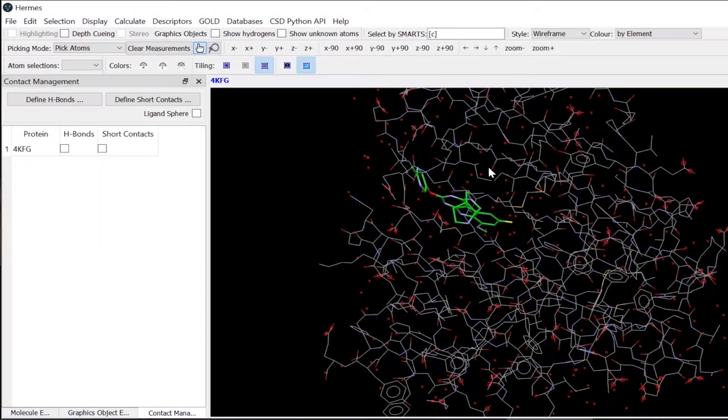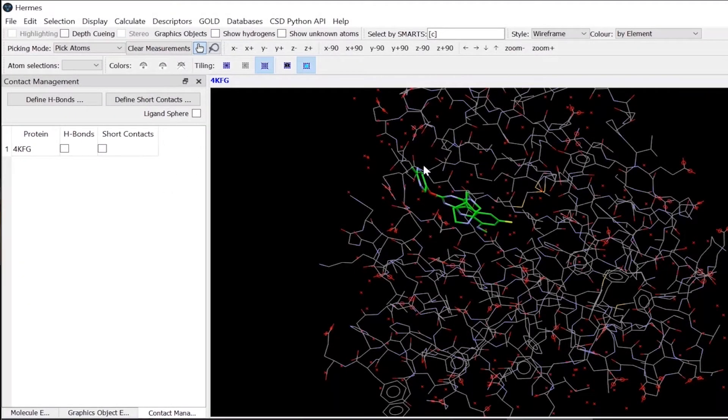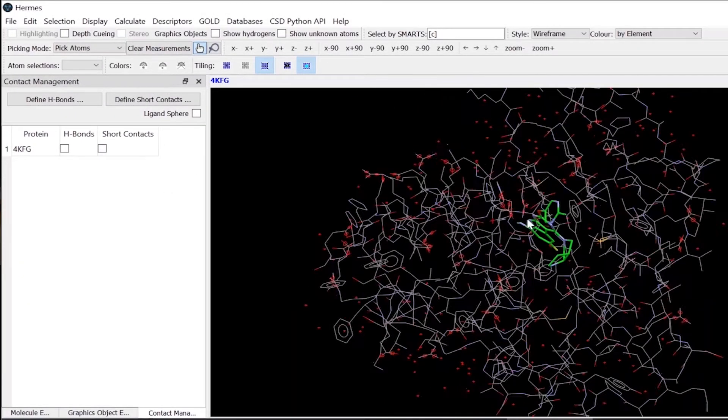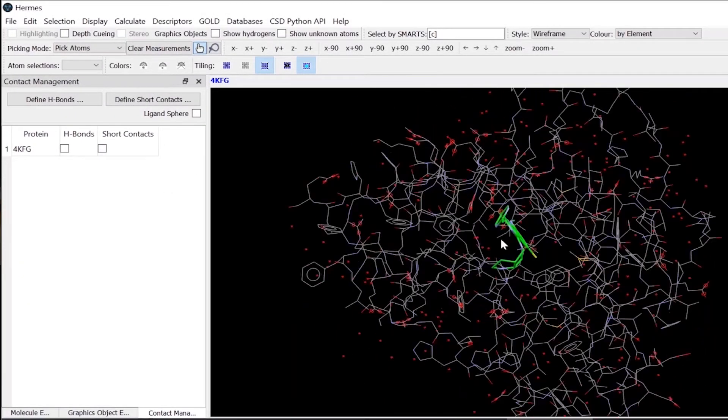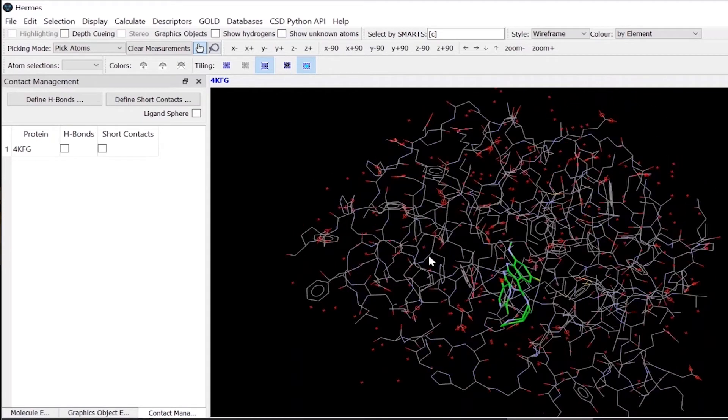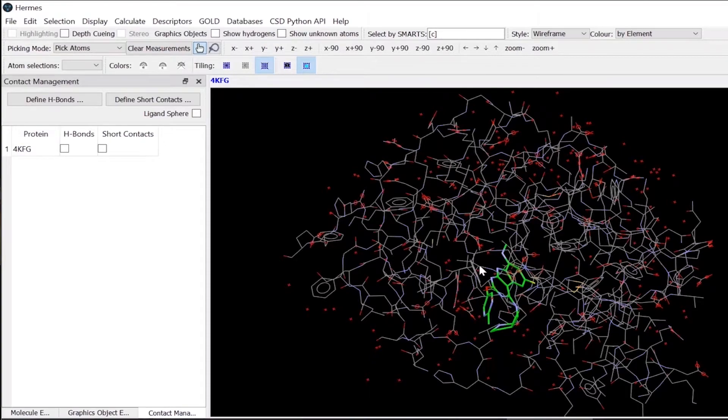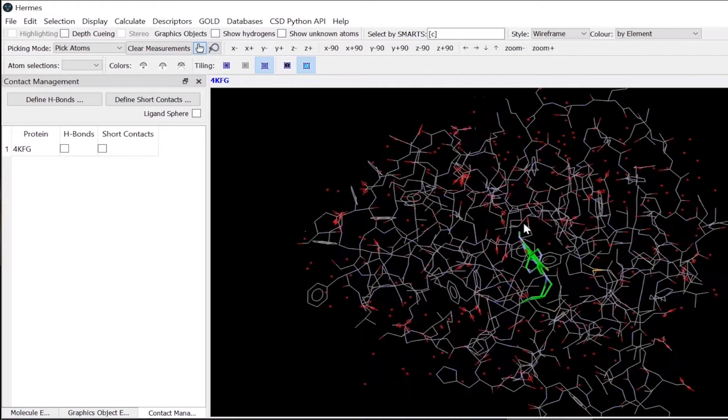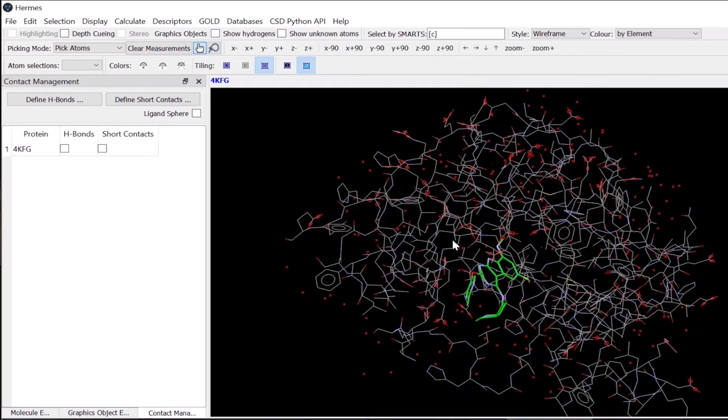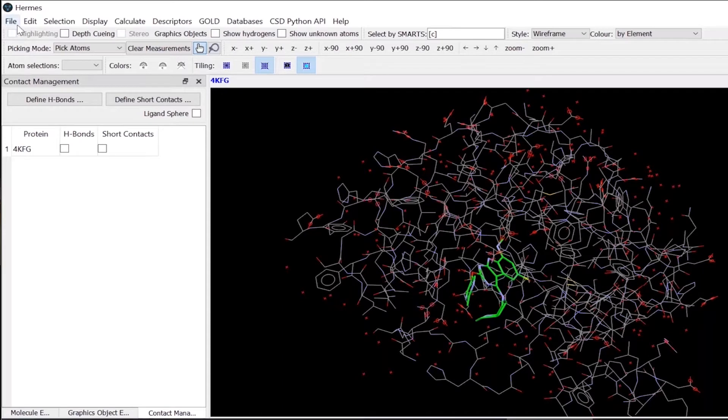So the HARME's graphical user interface looks like that. I have a protein which is 4KFG, which is a DNA gyrase protein from PDB.